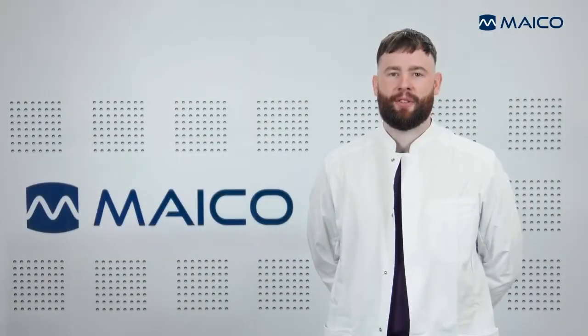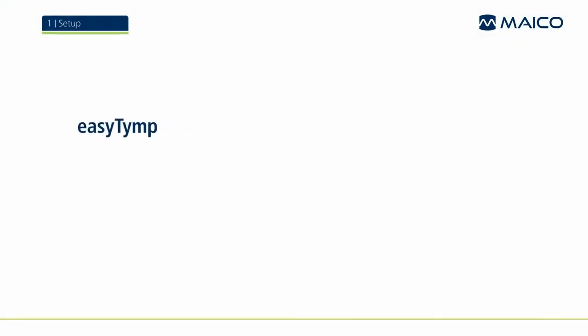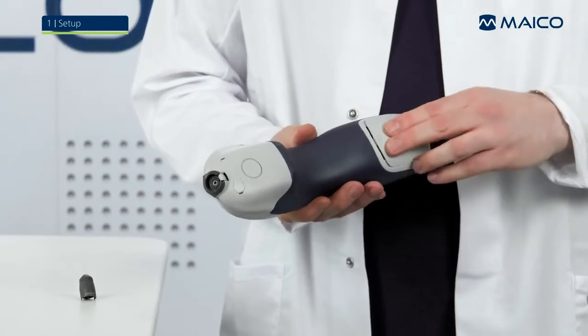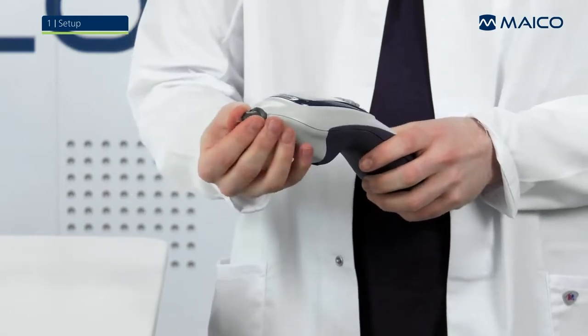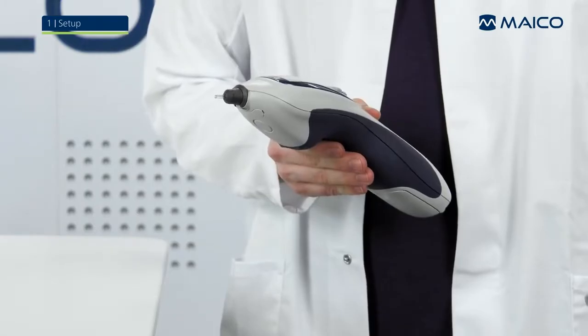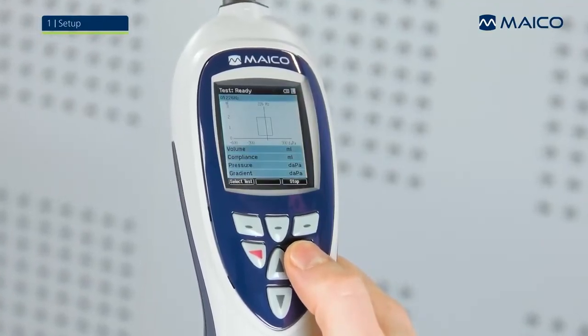This video will show you how to perform measurements of the middle ear using the Maico easyTymp line. Insert a fully charged battery into the device and connect the probe to the easyTymp. To get started, press either the red or blue arrow key to switch the device on.